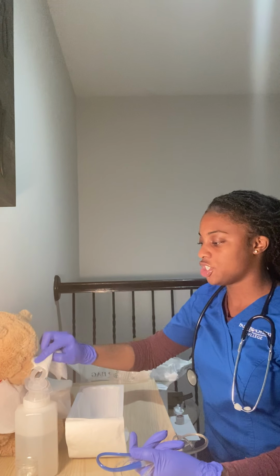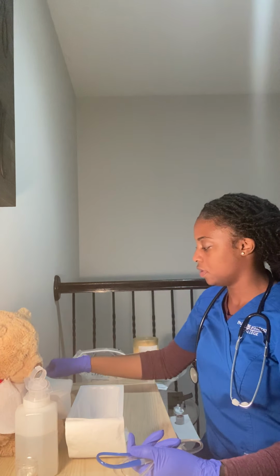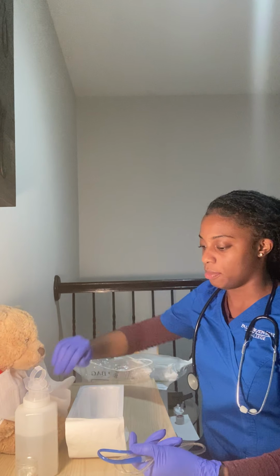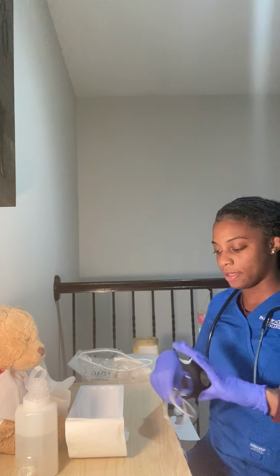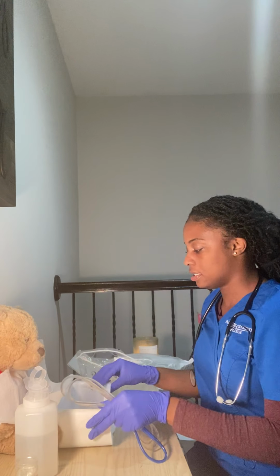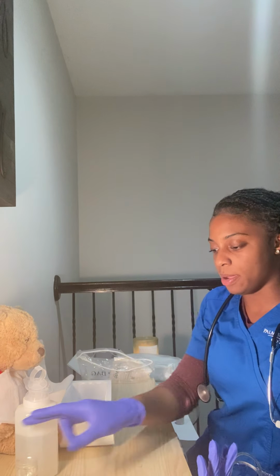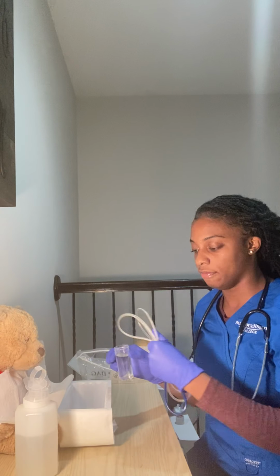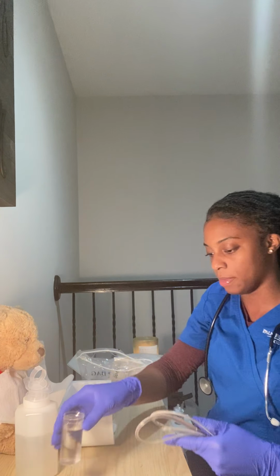I'm gonna wipe his nose, and we're just gonna wipe the bridge of his nose off and discard that. So now that we've got that done, I've done my abdominal assessment. I'm gonna go ahead and get my catheter ready. My patient's got the basin, and I've got my pH paper here and the water. I'm gonna let my patient know that they're gonna be taking big gulps of the water as I advance the catheter down into their stomach.